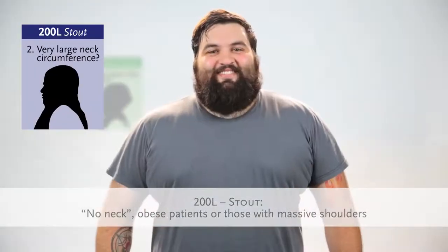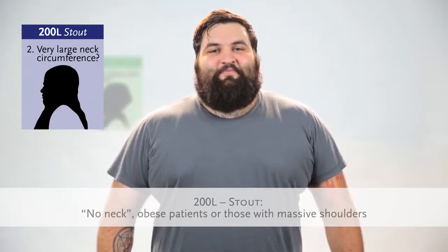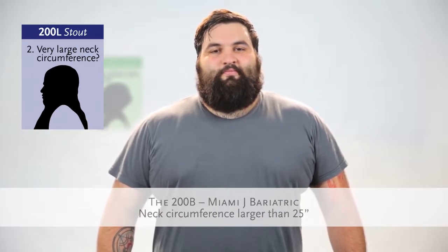Does your patient have a very large neck circumference? Consider using the Miami J stout collar, used for patients commonly referred to as no neck, typically obese patients or those with massive shoulders.